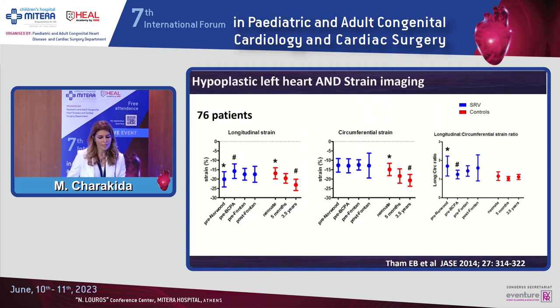You will appreciate that looking just at the red dots in the controls, the longitudinal strain tendency is to improve as we move on from the neonatal period to childhood. And the same pattern is followed for the circumferential strain.